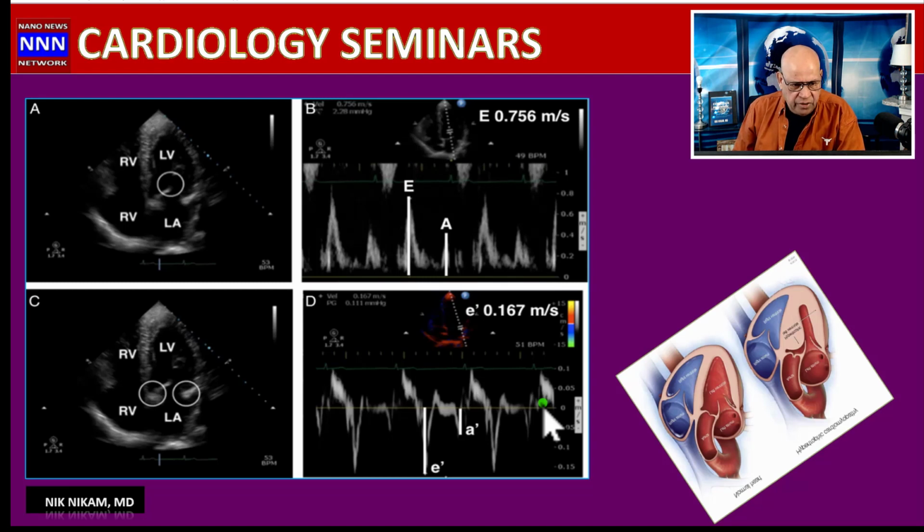Here's an echocardiogram showing the technique of obtaining these Doppler studies. Here we have the mitral valve velocity, where the Doppler is placed right at the tip of these leaflets. We measure the velocity of the mitral leaflets, and here is the diagram, which is sort of upside down to match this one. And here's where we place this one.